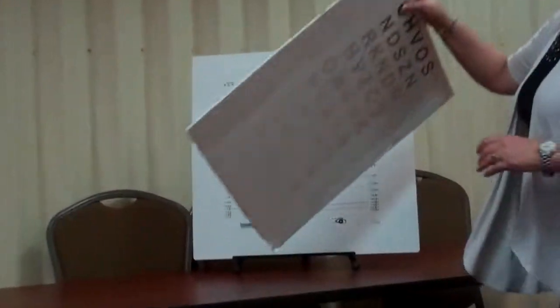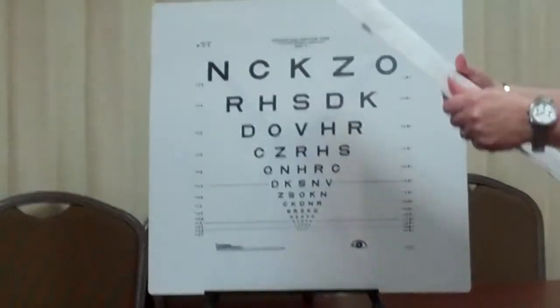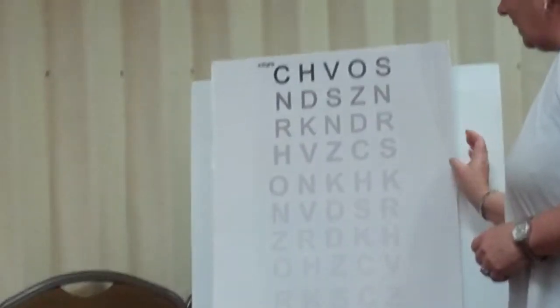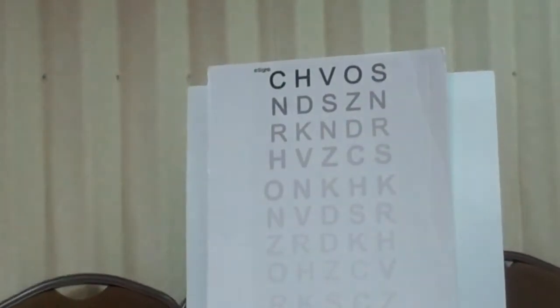So I'm just going to switch charts here. Bear with me. This is a contrast chart. Excuse me, it got squished in our luggage. All the letters are the same size. They just get really, really faint as they go down. You may have some difficulty with that top letter.